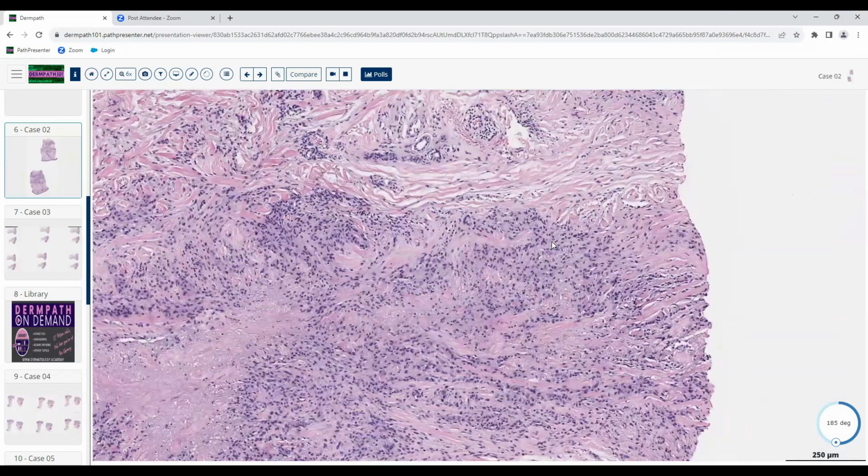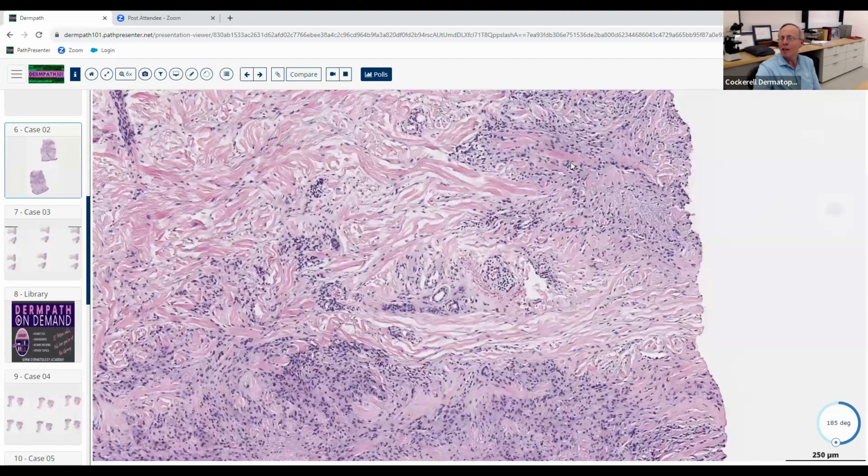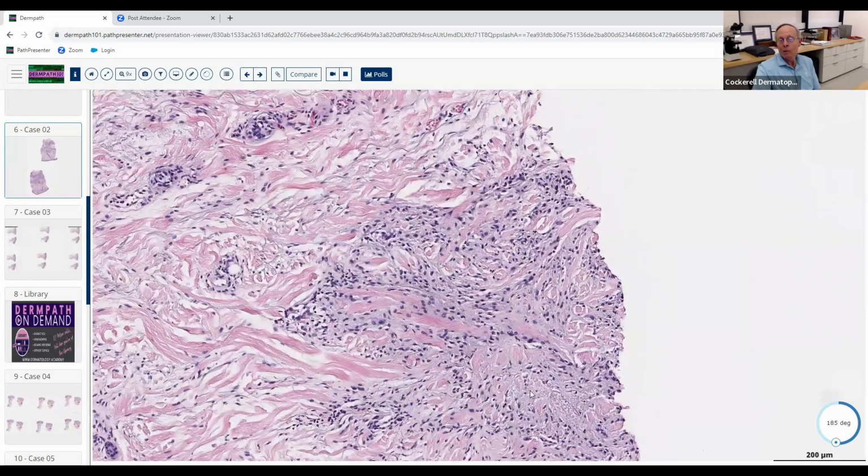Is it lupus miliaris? No, that's actually more of a tuberculoid granulomatous process, but necrobiosis lipoidica, NLD. So those are the three main ones we think about. We think of the three classic palisaded granulomatous dermatitis histologically. And how do you tell those apart? Okay, so what's the main way that we tell those apart?